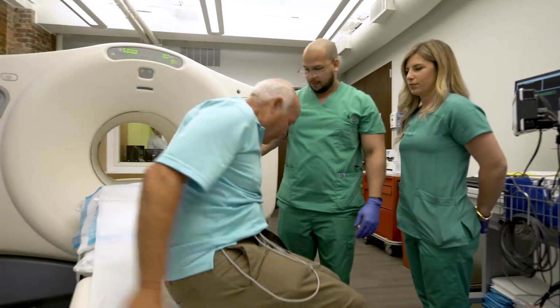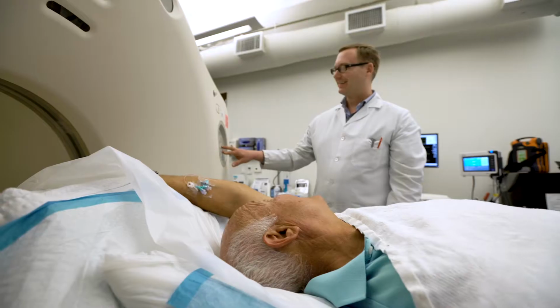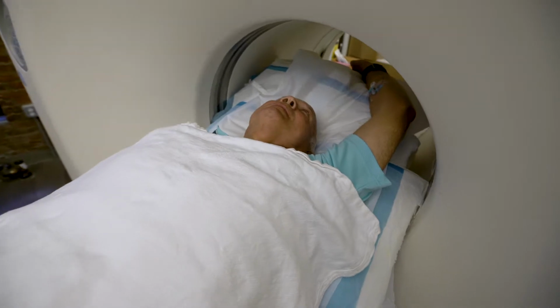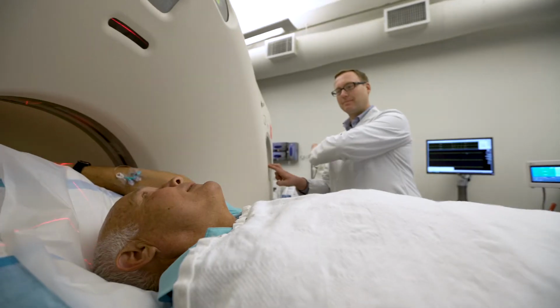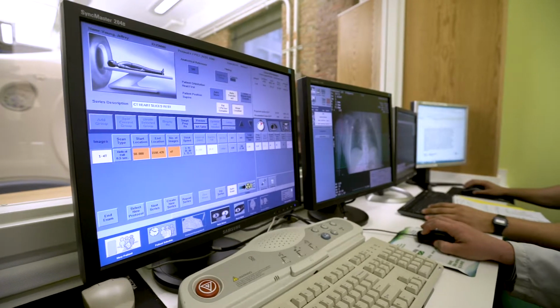The PET scanner, the machine which is used to perform the test, is different from an MRI machine. It's much more open. It does not cut off the view, and it is also not associated with the banging noises that you have in an MRI machine. There, a qualified nuclear technician will inject a radioisotope tracer which has no side effects. Patients then enter the PET scan machine and can relax and breathe normally.